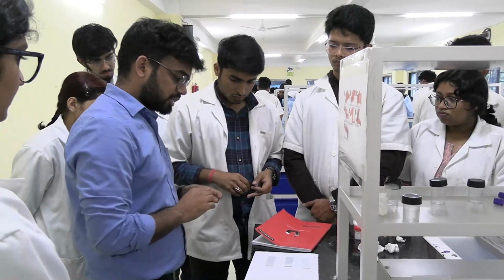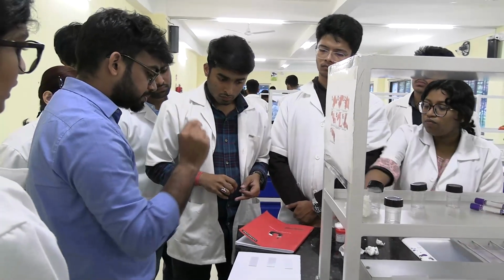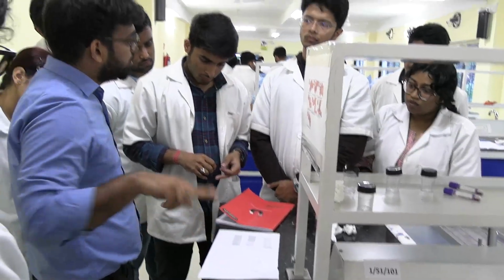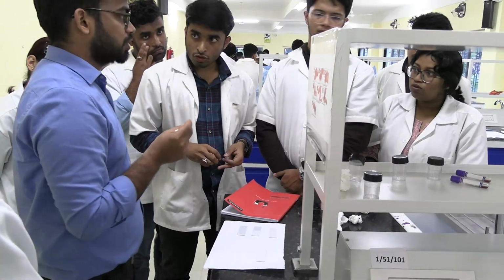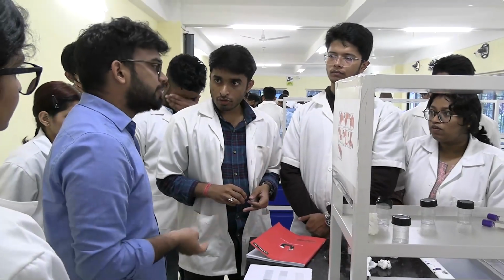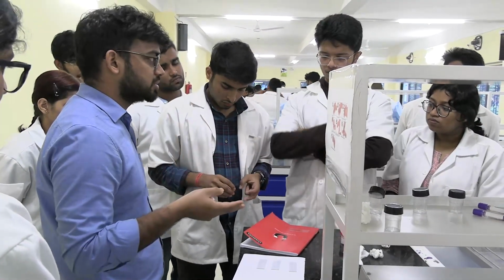Now we already know all the precautions. Why will you give that blood drop, and wherever you place it, about 1 centimeter away from the edges? Are you going to use the first drop? No, sir, the first drop needs to be wiped out. Why? Because of the tissue fluid; the blood cells there are not normal, and you can see more WBCs here, so it should not be used.